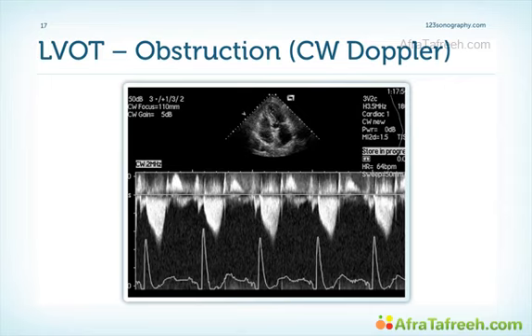So as you just saw, the morphology and color Doppler usually leads to the right diagnosis, but we also want to quantify the degree of obstruction. To do that, we look at the maximum velocity and then again convert these velocities to gradients with help of the Bernoulli equation. Usually we have velocities of somewhere in the range of maybe 1 to 1.4 meters per second at most in the LVOT. In the setting of obstructive hypertrophic cardiomyopathy, those velocities can range sometimes even 6 meters.